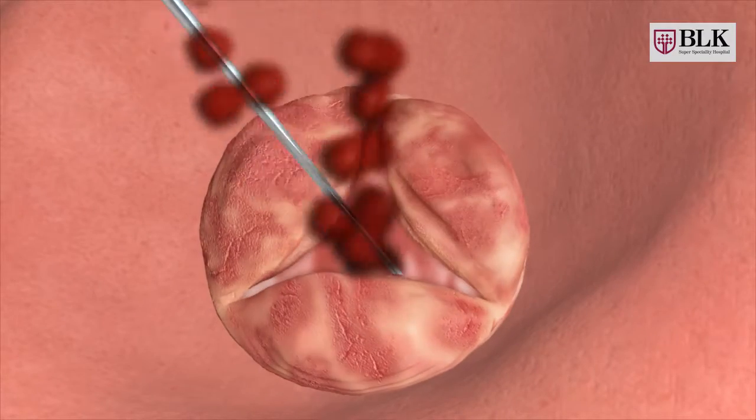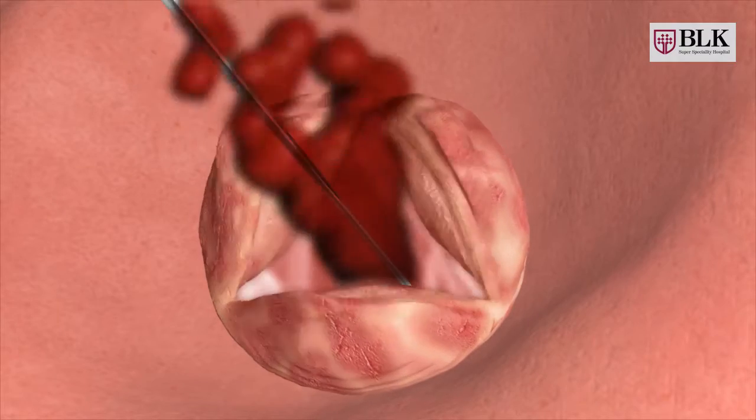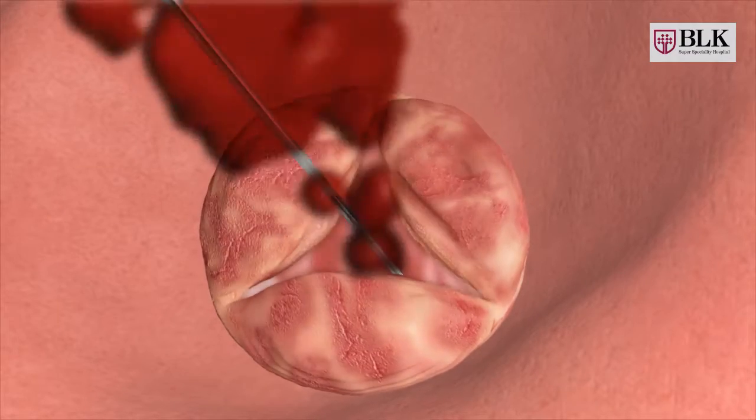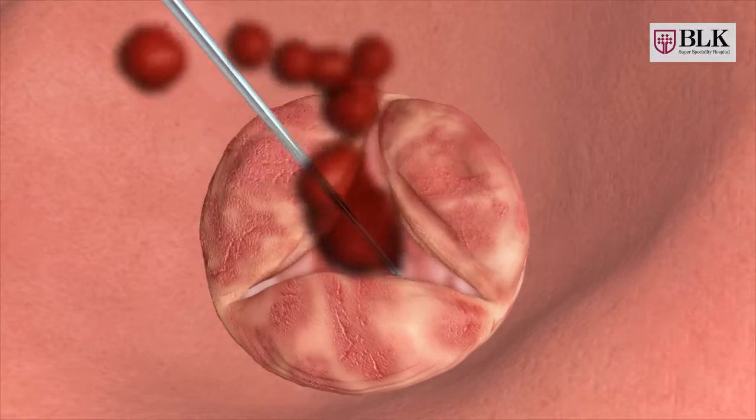As you can see on your screen, the leaflets of the aortic valve do not close or open fully. This is caused by many factors like lifestyle habits, aging, and degenerative disease.